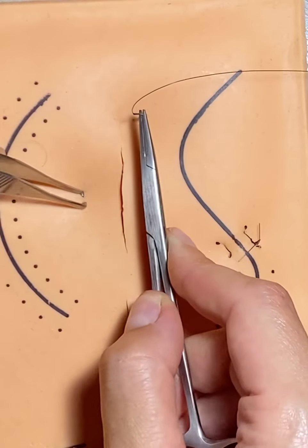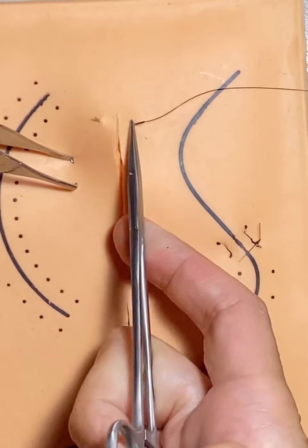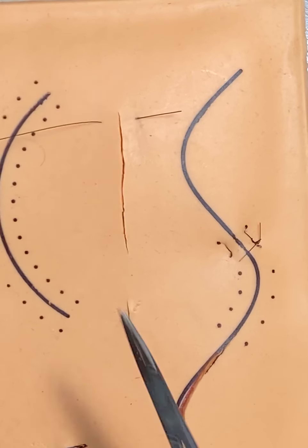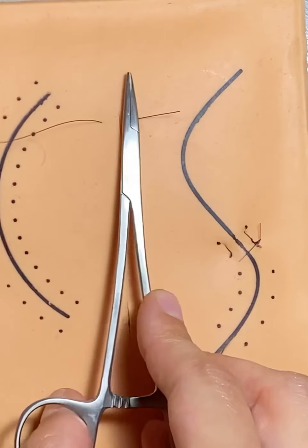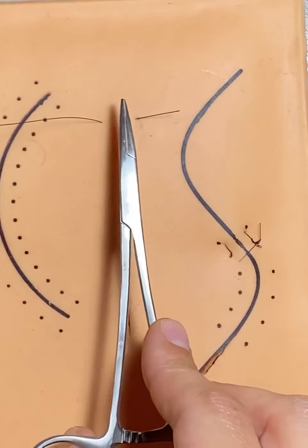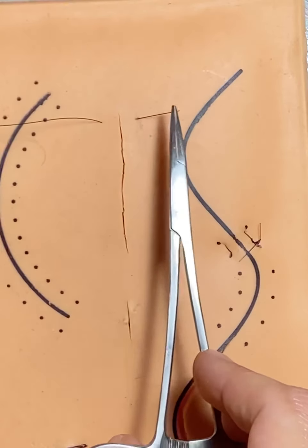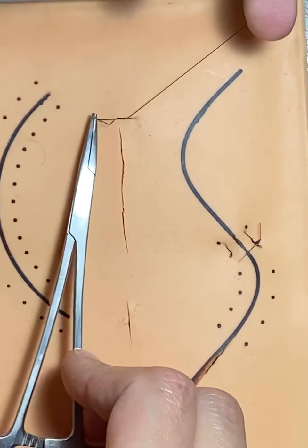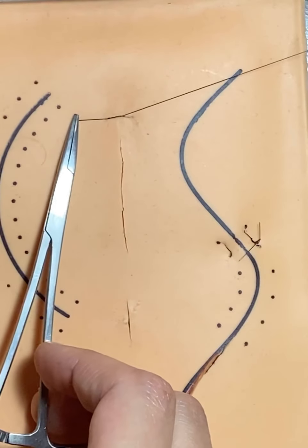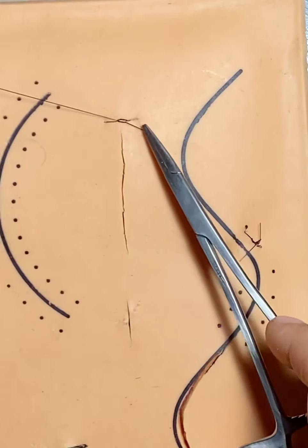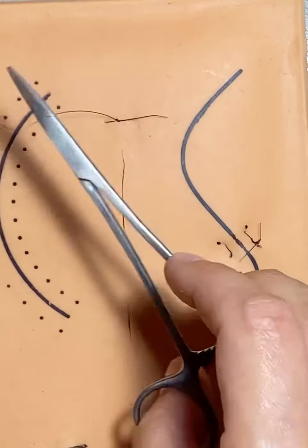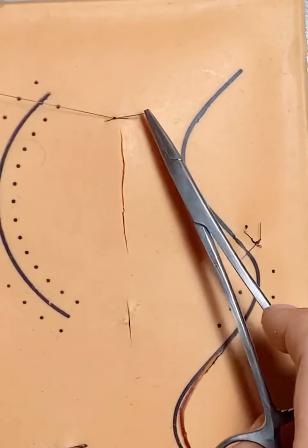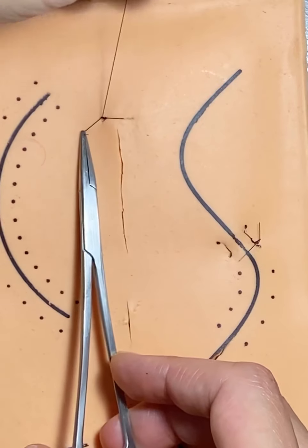We start at the top of our wound with one simple interrupted. Tie it the same way that we tie everything else. You put your needle driver in between your two tails here, your tail and your suture line. Two loops, surgeon's knot, there's your square knot. One, two, three, four. I like to do a couple extra on this one because it's really our only knot holding it in place.